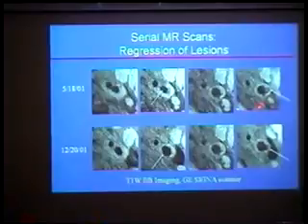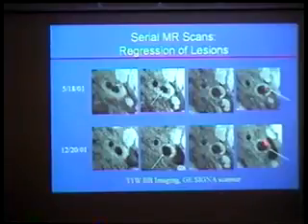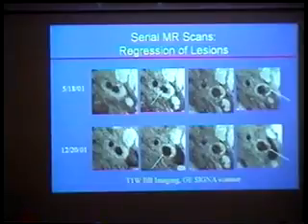What is also interesting is that you see some evolution within this region. At time 1, there are 2 pieces of calcium separated by some other material in the middle. At time 2, these 2 pieces of calcium have pretty much merged into 1 piece, and the material in the middle has basically disappeared.